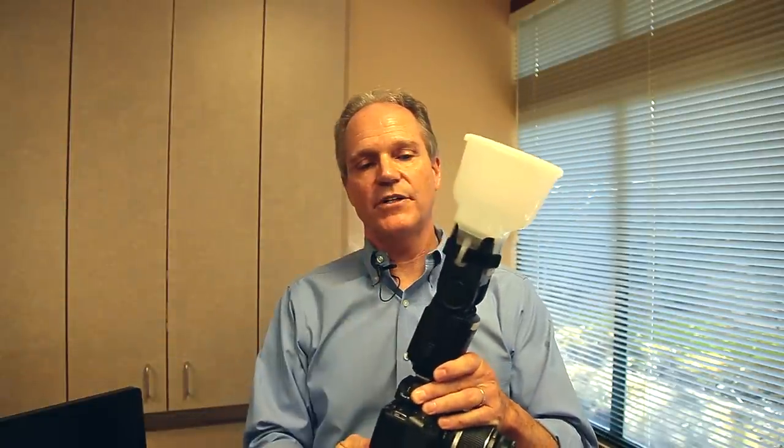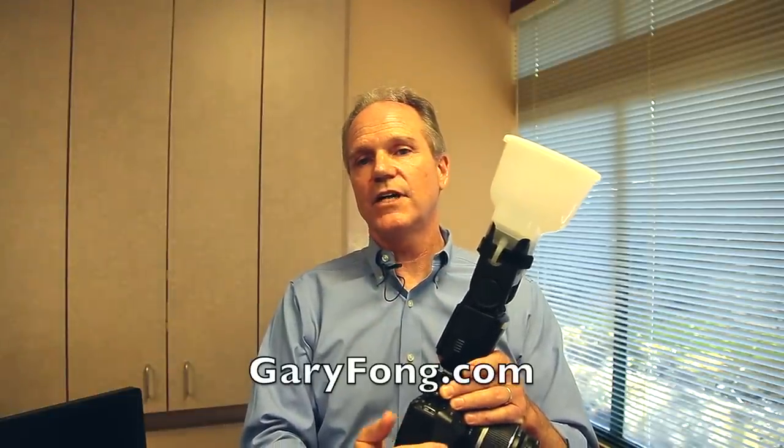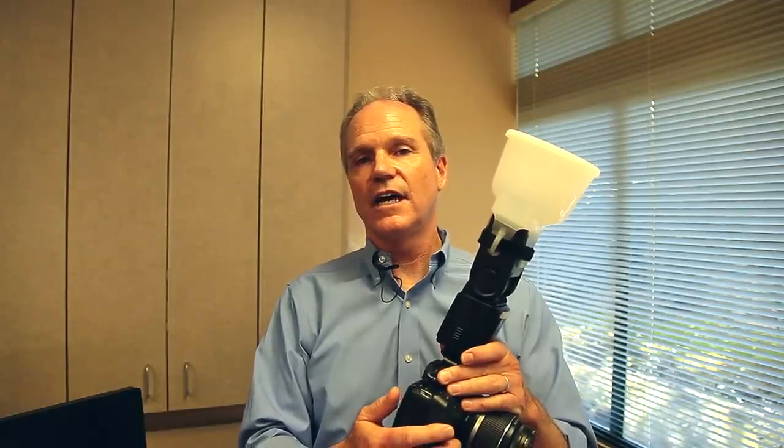The second camera I use is also a Canon Rebel. This one is set up for portraits and if you notice I have a diffuser up on top. The diffuser you can get from GaryFong.com. He also has a complete portrait kit for doing nice portrait photography. It's well worth getting and I think you'll appreciate having that in your office.